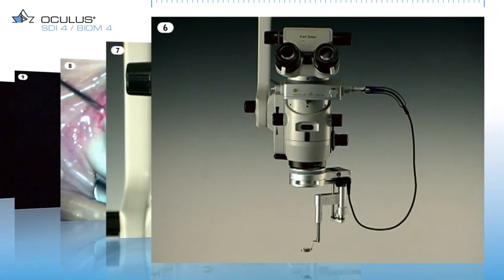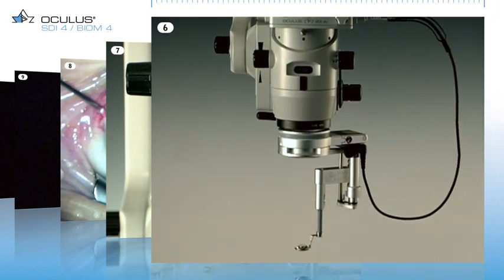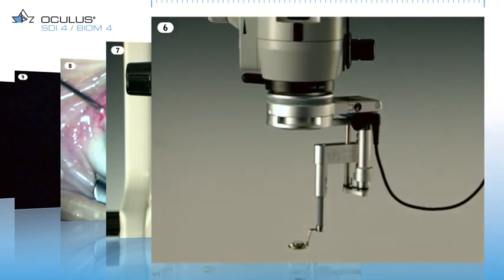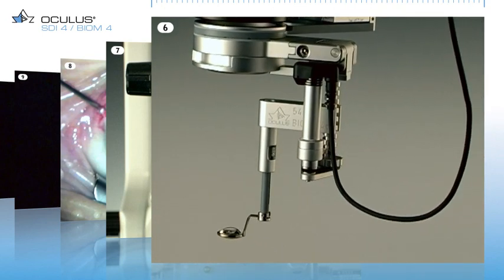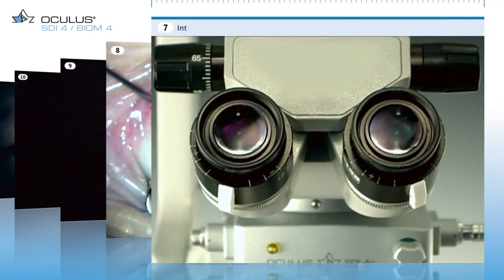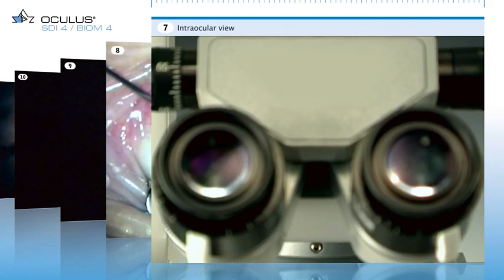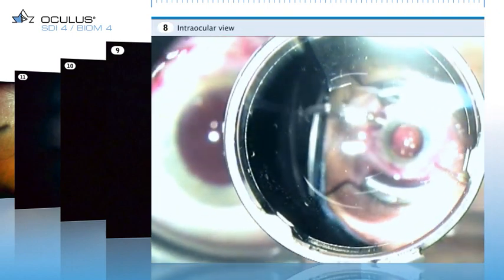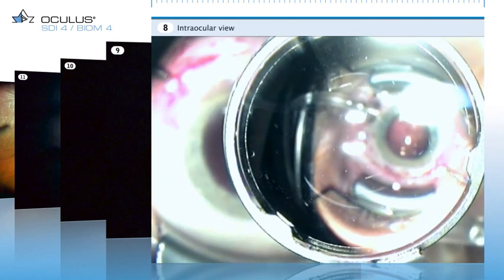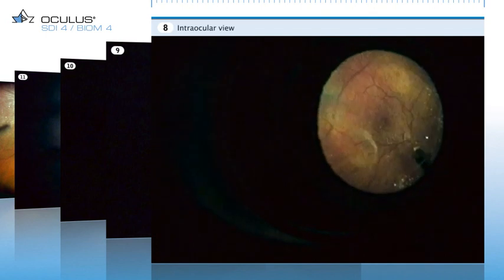This is the sterile, fully mounted Biome 4C on the operating microscope. This Biome version allows powered focus adjustment. A view through the operating microscope. Now you see the front lens swing into position and the image put into focus with the Biome focus adjustment wheel. This promptly gives a sharp image of the fundus.